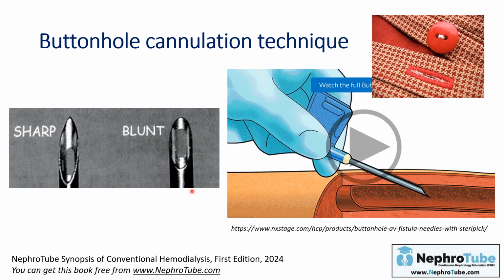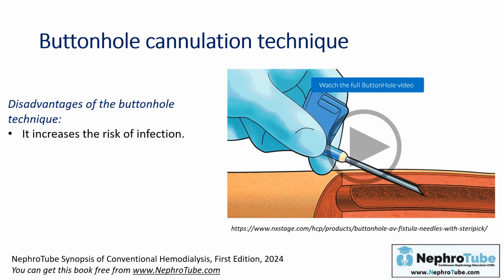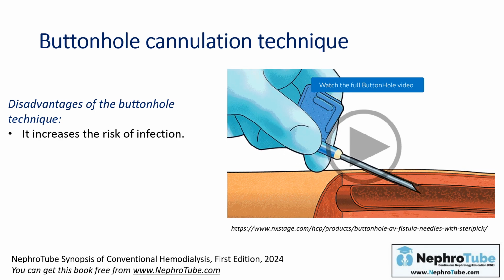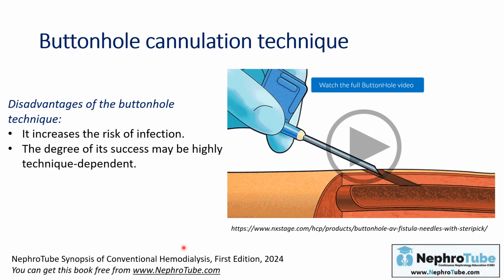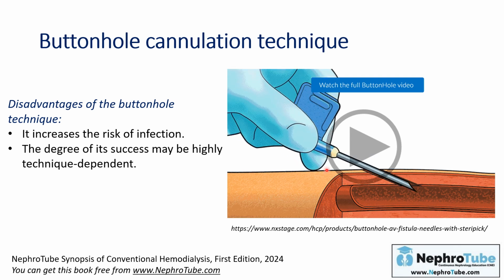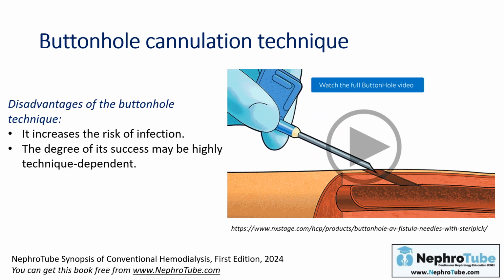So what are the disadvantages of this buttonhole technique? The first, it increases the risk of infection. It carries a high risk of infection. That's why it is important to follow strict antiseptic measures while using this technique. The second is that its success is highly technique dependent. As I mentioned, you have to create the tract, and you should cannulate every time at the same angle, same depth, and so on. So it is a very difficult technique.